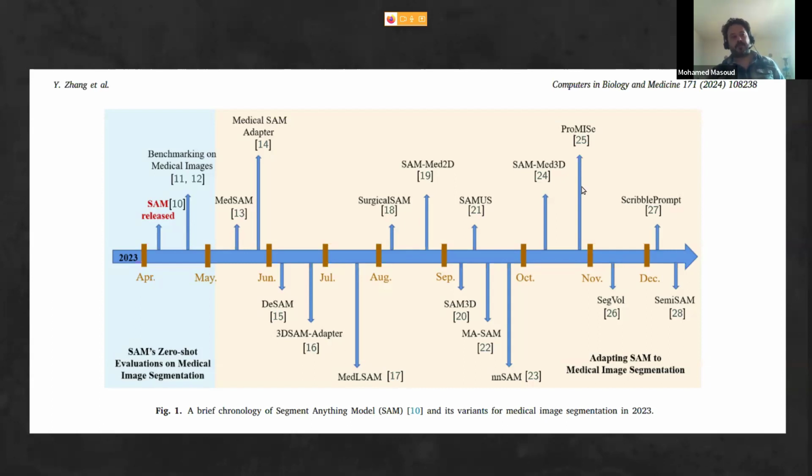I think you could probably do the bounding box thing without conditioning the neural network on it, by just doing segmentation and getting the largest connected component's bounding box. Yeah, bounding box is easy when you have the parameters. But 3D would be much more interesting. I wonder how it works.